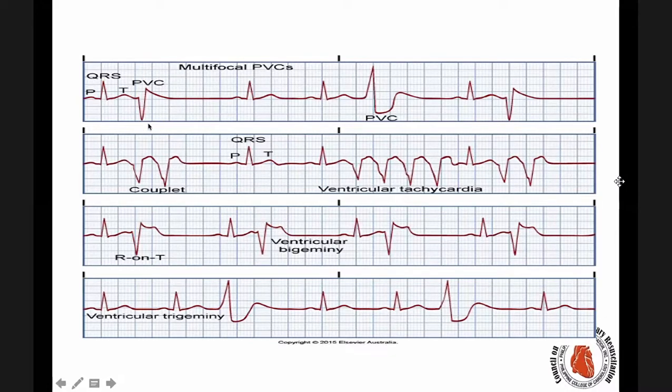So this is an inverted PVC, this is an upright PVC. So we can say that it's a couplet. Ibig sabihin, magdalawa sila. Pero pag paisa-isa lang, pwede natin tawagin siyang occurring singly, a premature ventricular contraction occurring singly. Or pag dalawa na sila, we will say it's a couplet. However, pag maging tatlong sabay-sabay na ang PVC, we will now call it a non-sustained ventricular tachycardia or VTAC na siya. Okay, let me clarify.